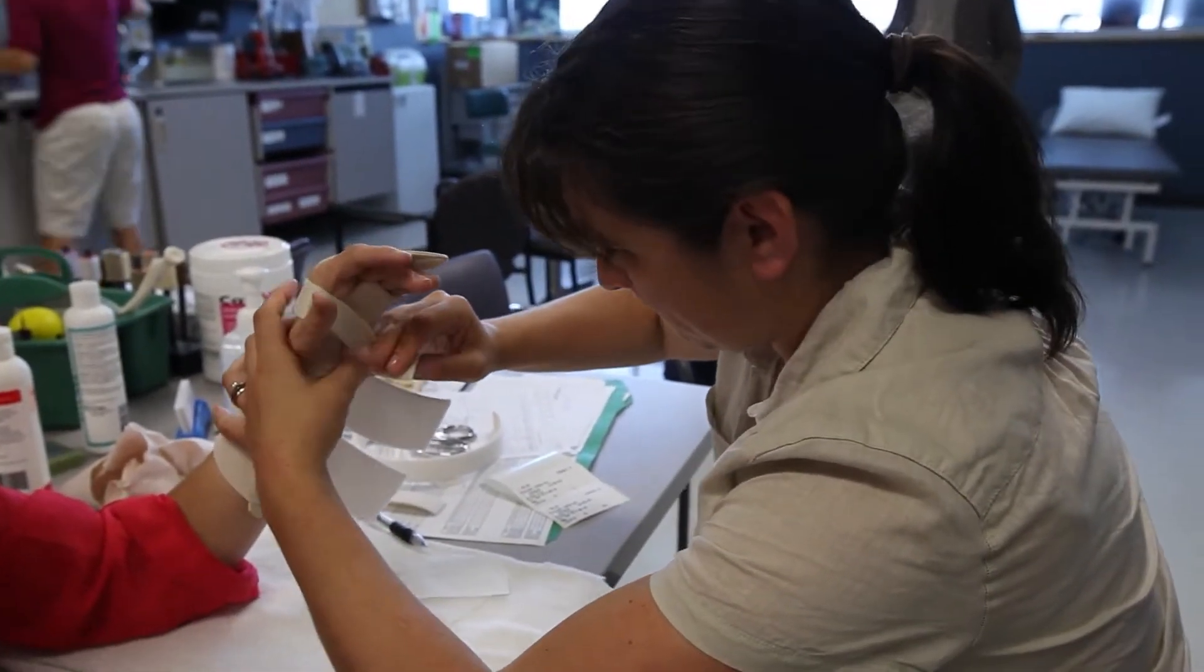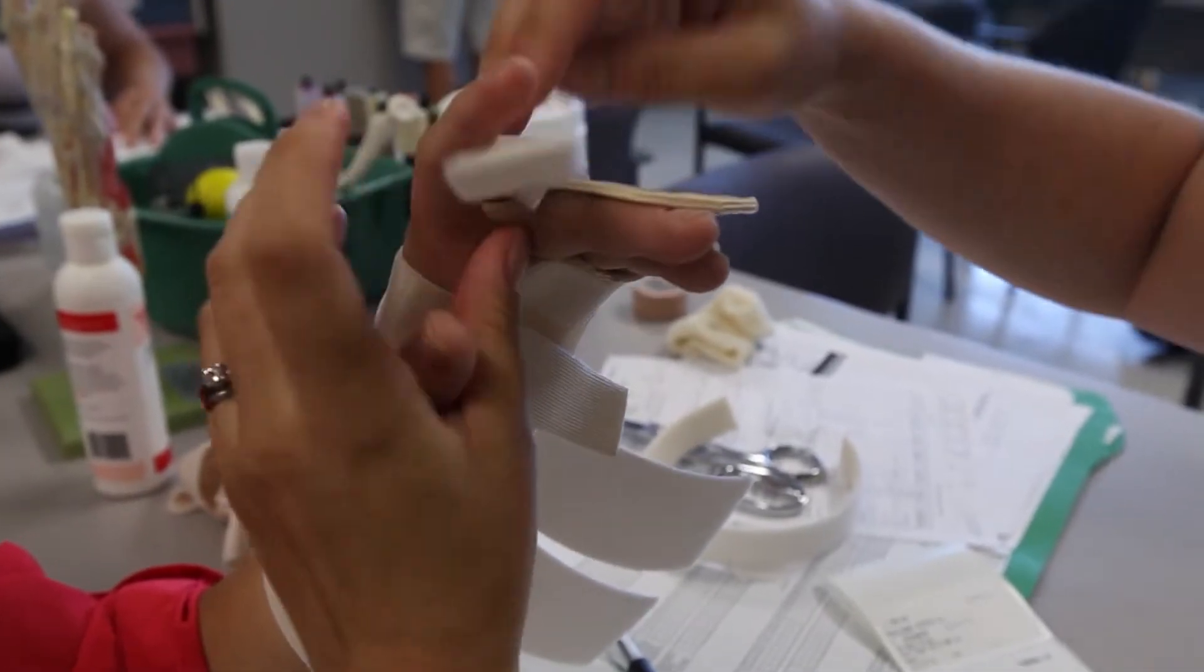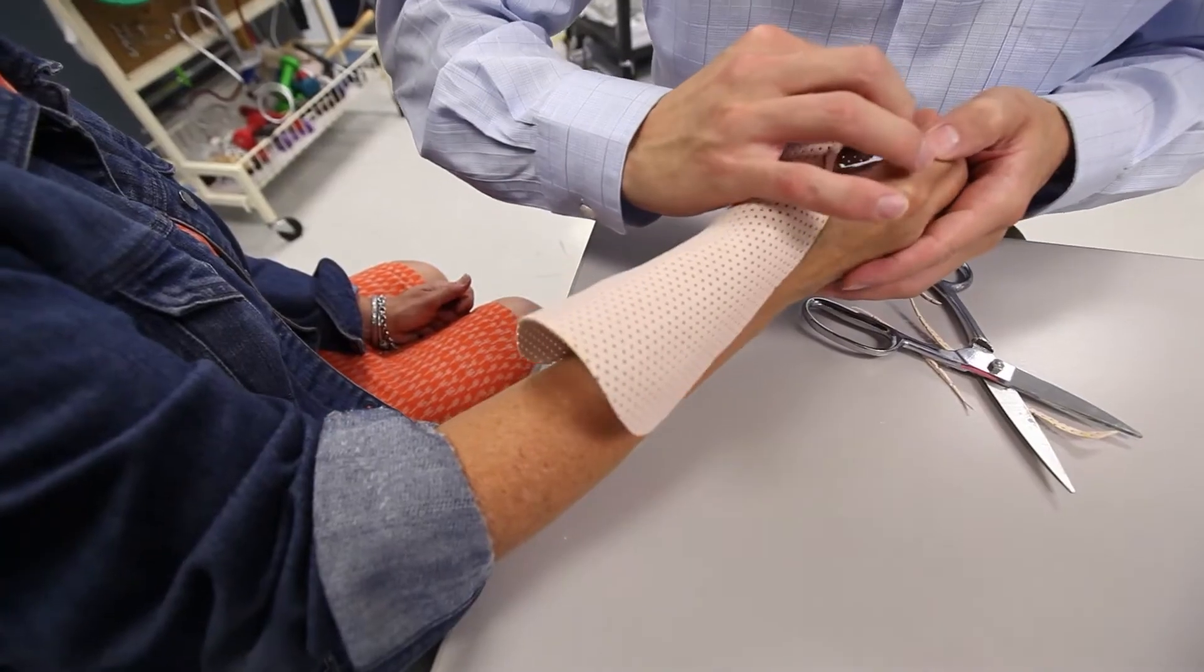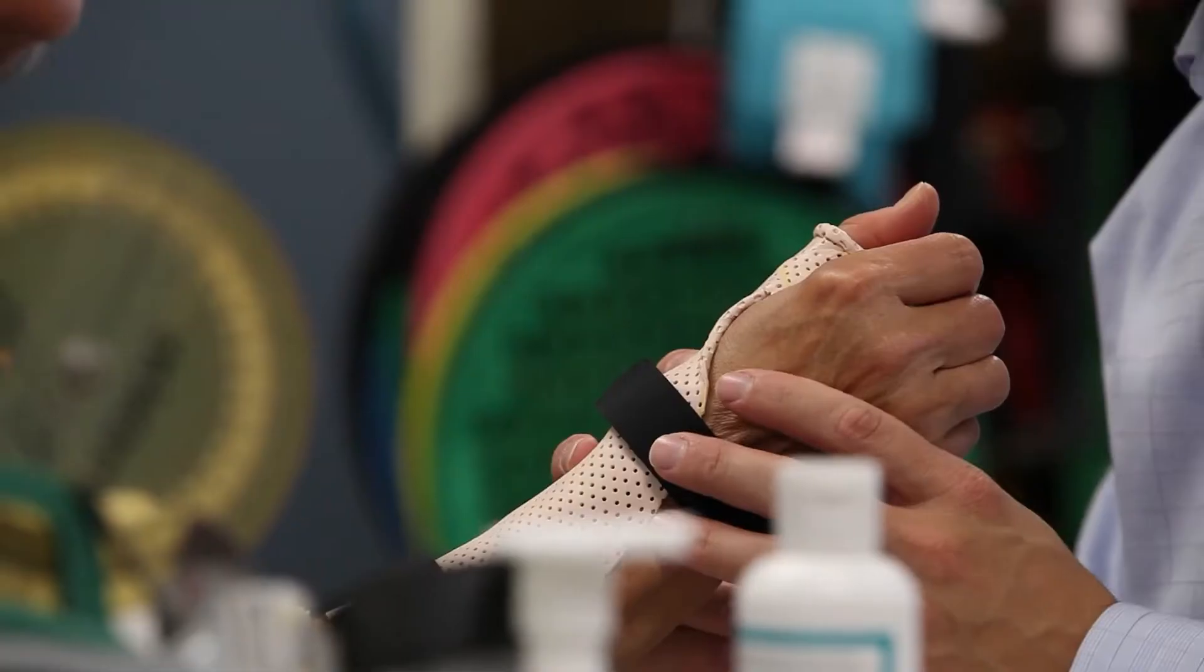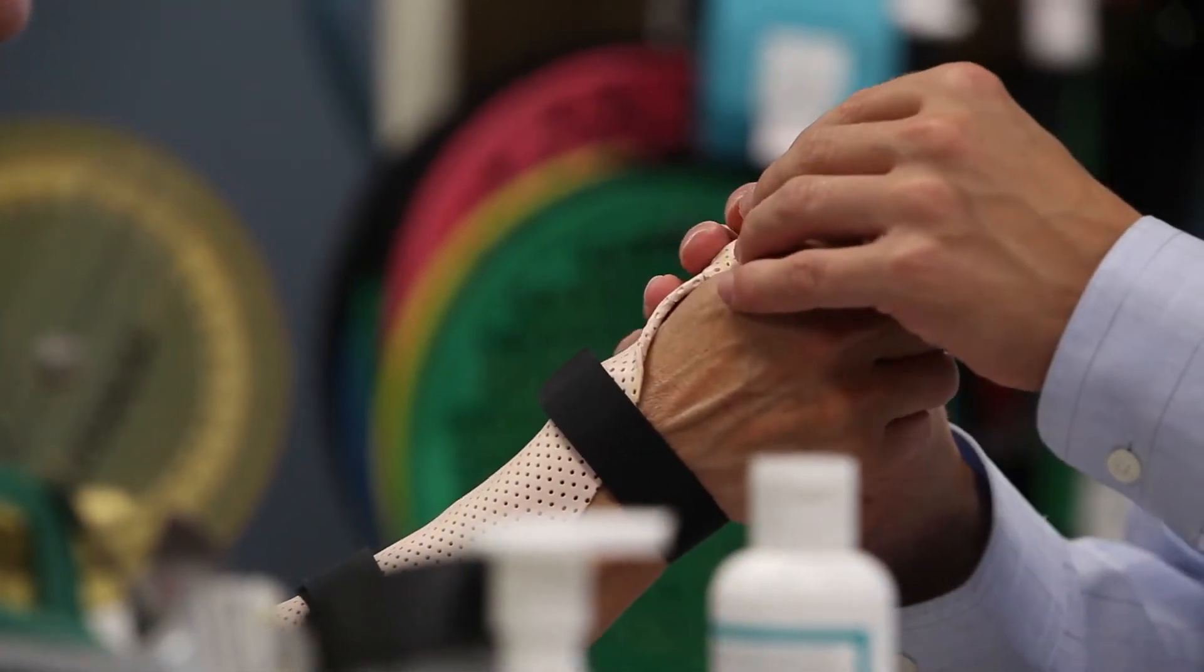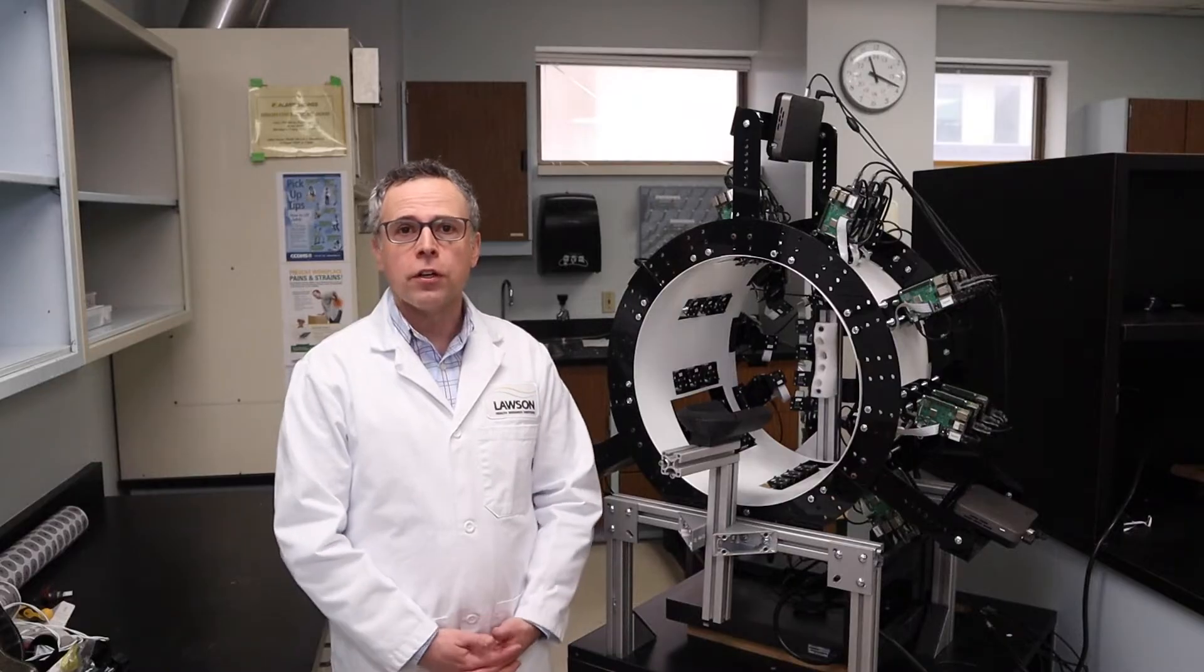can be very uncomfortable, very hot, very sweaty. Therapists report that patients have trouble complying with the splints, which means they have trouble wearing them. A splint only works for treating a patient if they can actually wear it for a long period of time.